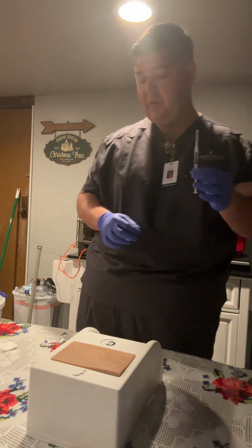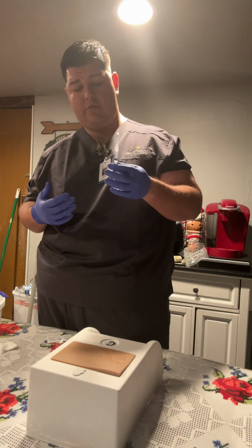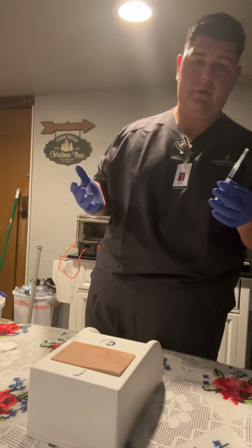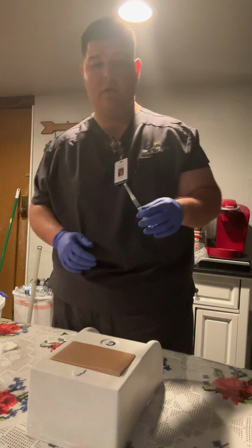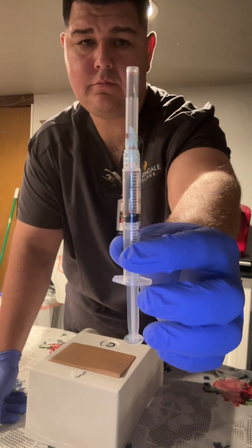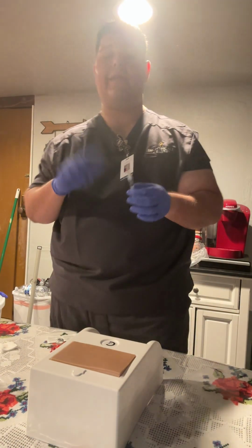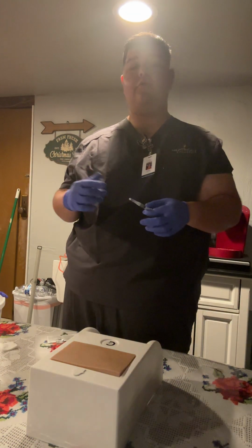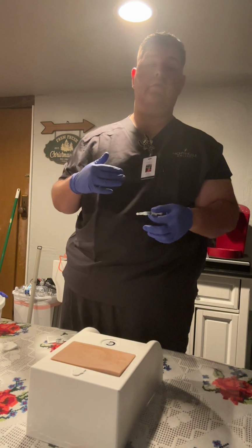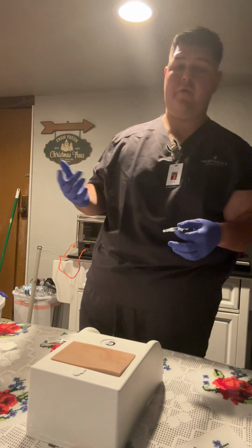There is a little bit of the medication in the syringe from my previous practice, so I'm going to assume that there's nothing in there. I wanted to point that out. I'm going to bring that up close to the camera. That's 1.5 milliliters. I want to take this air and inject it into the vial and then draw up the medication. As I'm drawing up the medication, I will invert the vial and draw the medication at 1.5 milliliters.